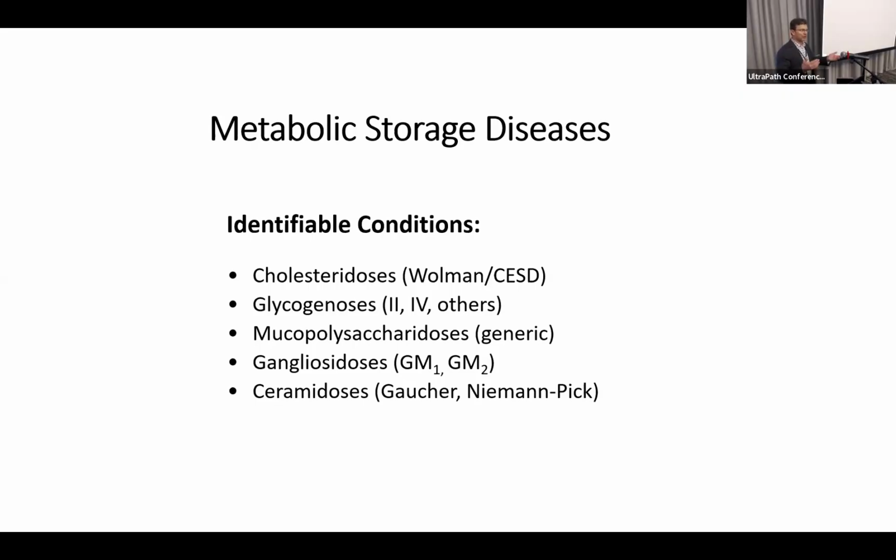Is there any structural correlation? So now we're doing EM to either confirm or to see if we can see the structural problem that these variants may cause, a pathologic variant that just hasn't been reported yet. There have probably been a half dozen or more in just the past couple of years where these were variants of unknown significance that we've been able to show are significant.